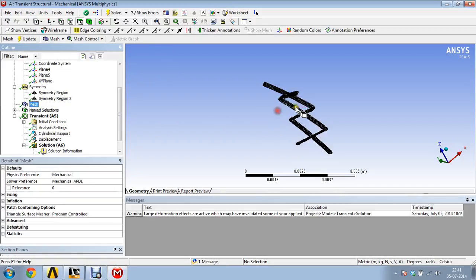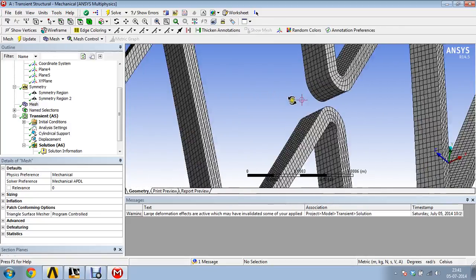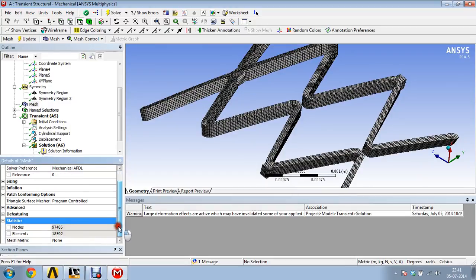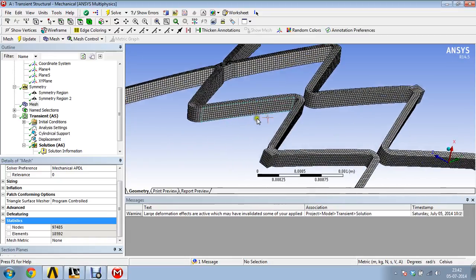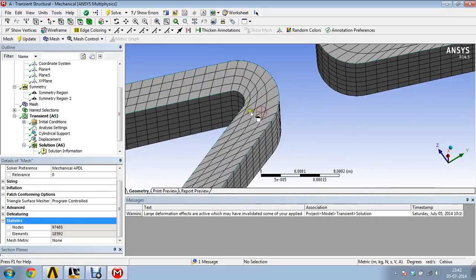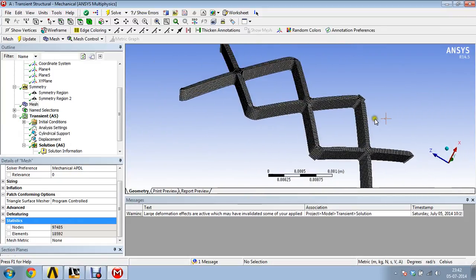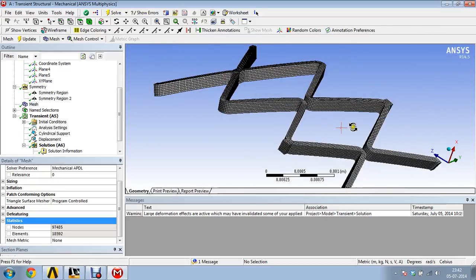Okay, you can see the mesh. It is not a very fine mesh, but for this laptop's capability, it is quite enough. There are around 1 lakh nodes, so there would be around 3 lakh equations to solve. So it is quite sufficient and we can get results in very good time. We can observe there is some skewness which has to be improved. Some more work has to be done on the mesh, but this time our focus is on finding stresses and deformations while applying the pressure and boundary conditions.